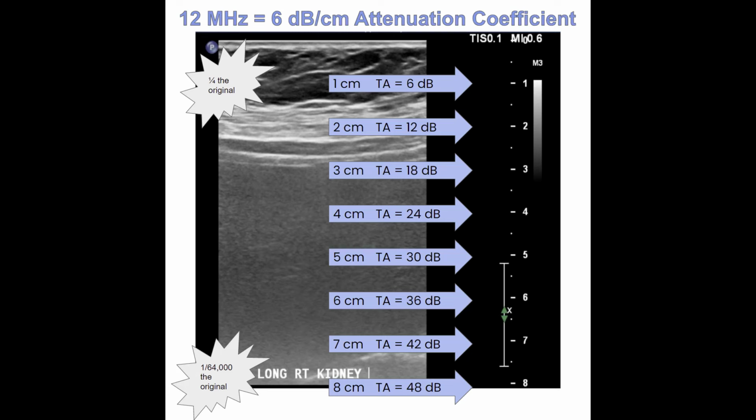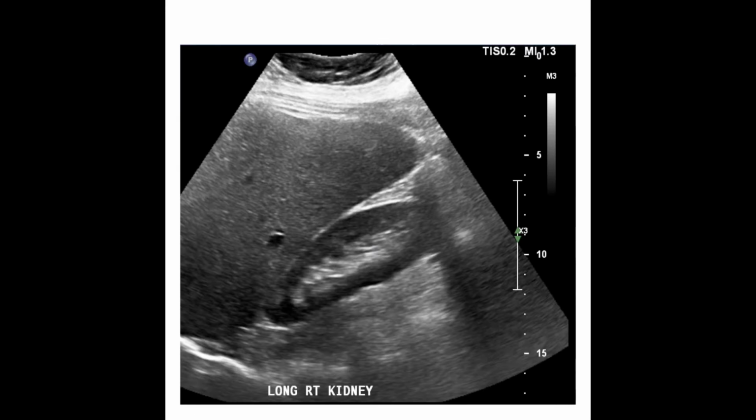And that verifies that this high frequency is going to attenuate very quickly, being just a fraction of its original intensity at just 8 centimeters. Well, let's compare that then to our 2 megahertz transducer.